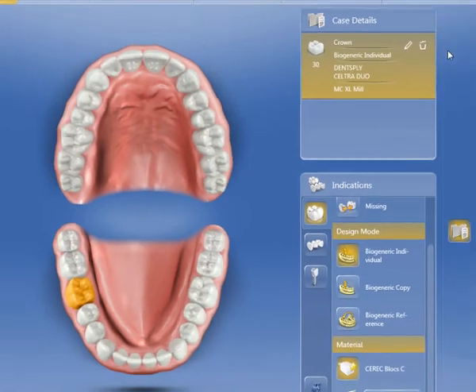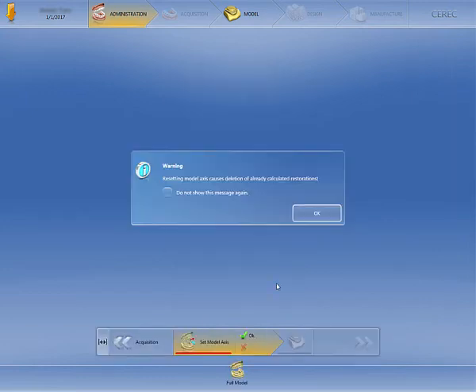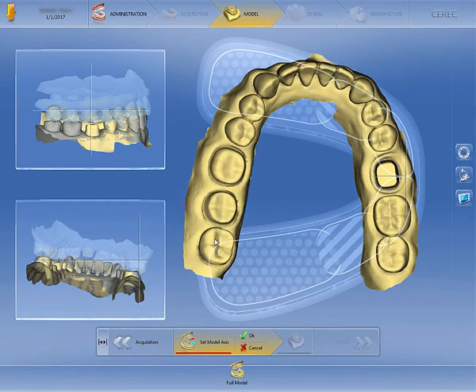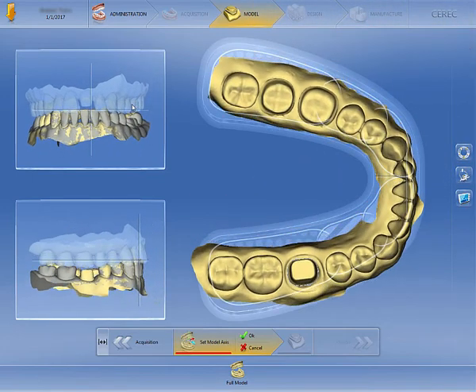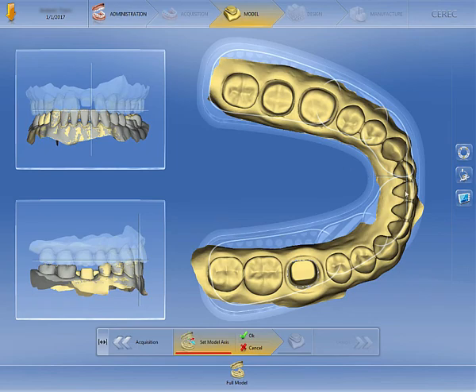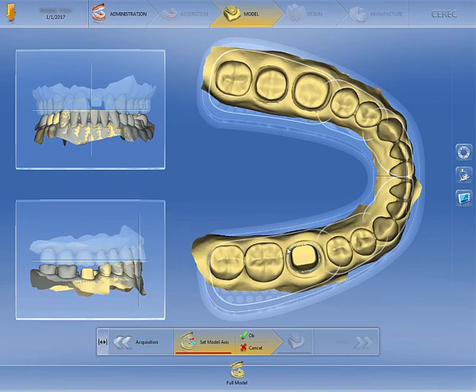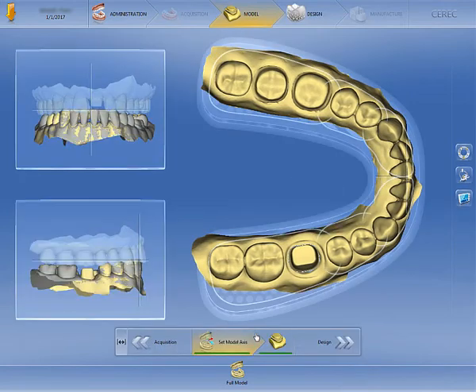Now we're ready to move on to the design. You may see a warning that resetting the model axis causes deletion of already calculated restorations. Since we haven't designed any restorations yet, you can click OK. Next, we're going to align the models to the axis, and click OK to save. You'll notice that we don't need to draw the margin line, as this was already imported with the Atlantis core file.